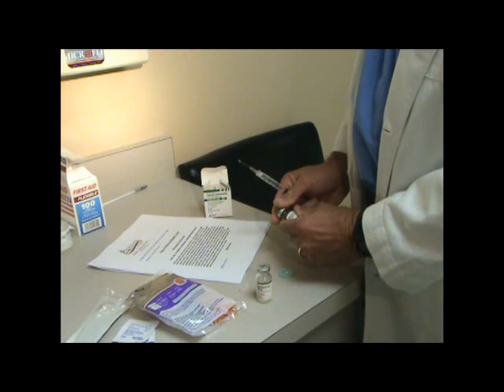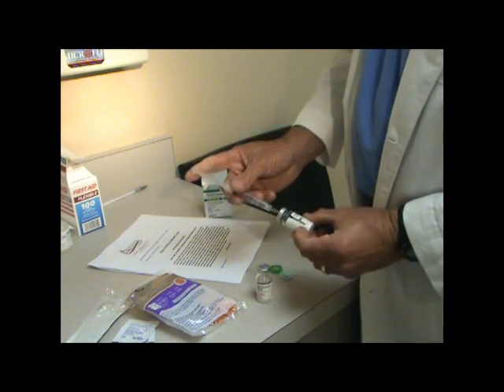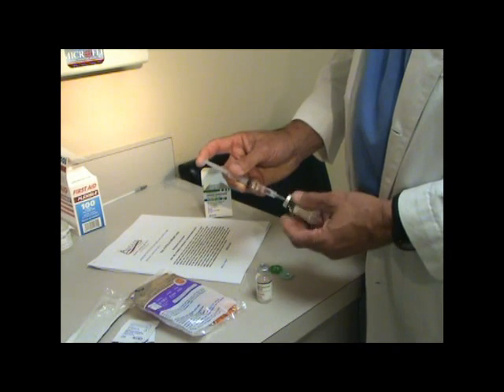Next, this is the powdered form. Take it and put it directly in through the center, and rotate the vial as you slowly inject with the other hand.